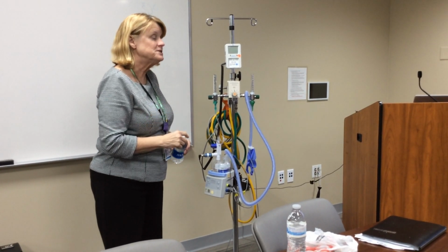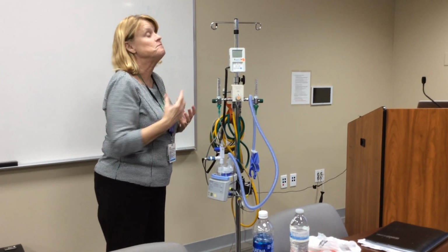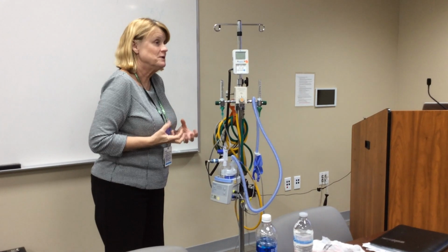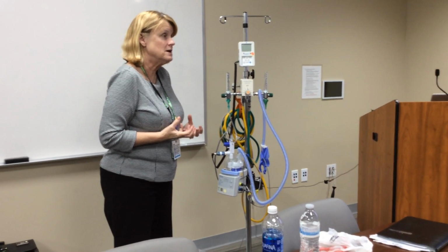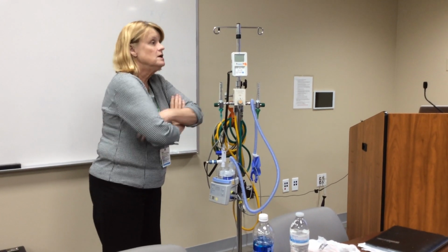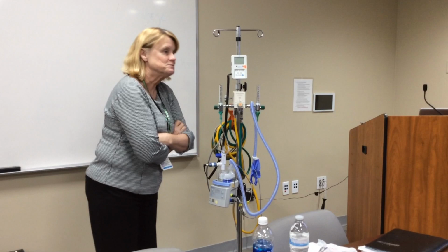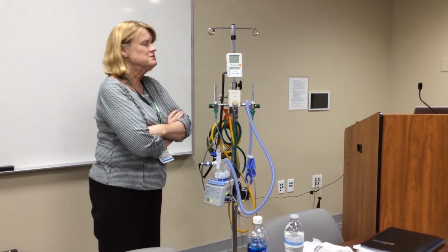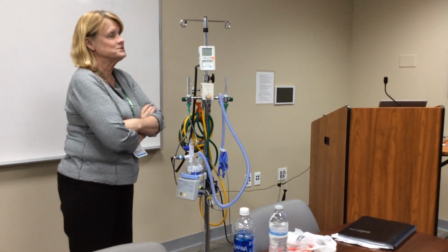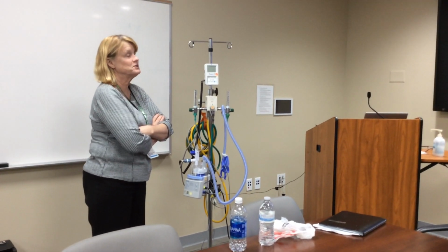And sometimes that is, the more PEEP, that can increase their saturations, because now they're not working so much and they're keeping the alveoli open so the oxygen can go back and forth. So increasing the flow rate inadvertently helps with saturation. There's not a lot of PEEP created by this device, though. If there was, it would have to be monitored a lot closer, but there is some.